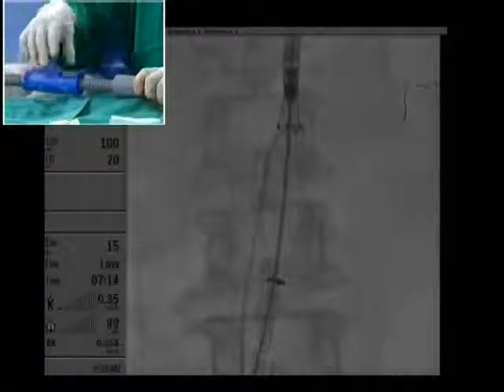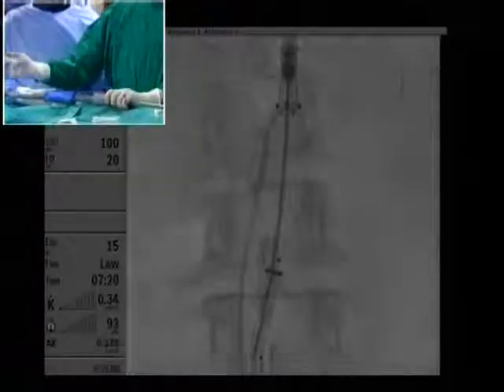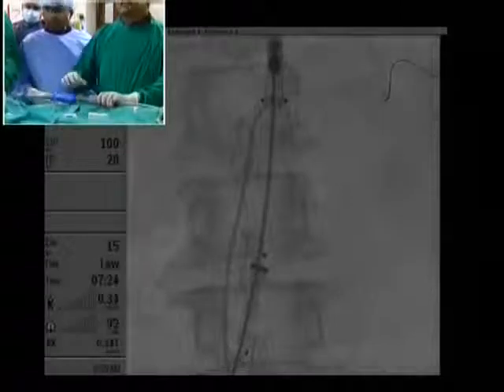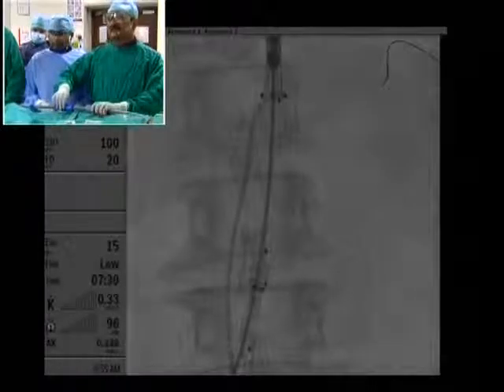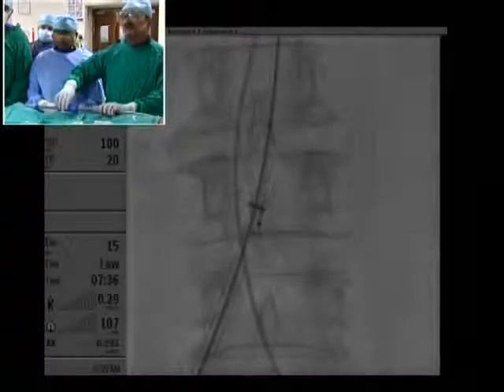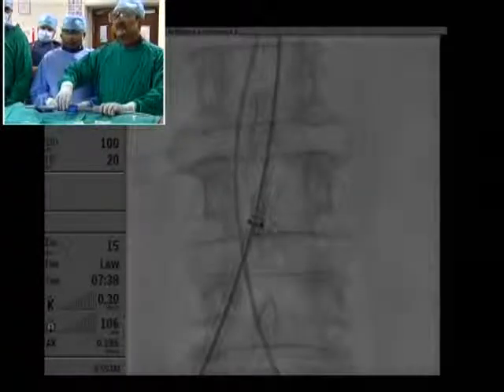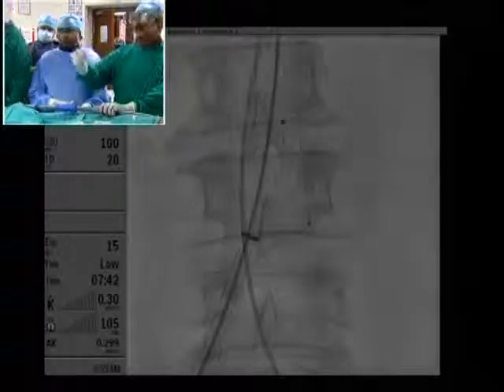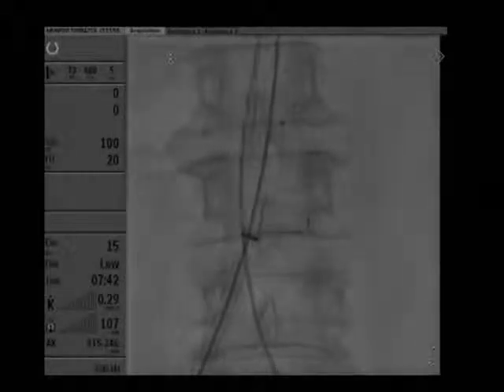So I'm continuing the release. Now the main body has been released. Now I'm beginning to open the region where there's a contra gate. Just one last test there. Okay, it's a conservative position. I'm a millimeter below the renals actually. Show lower down. Now we'll actually see the contra gate springing open. There you can see it just acquired that. You can play that back again. So that's the contra gate opening onto the left side.